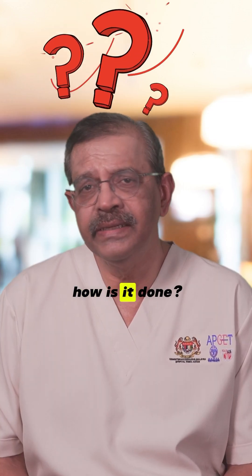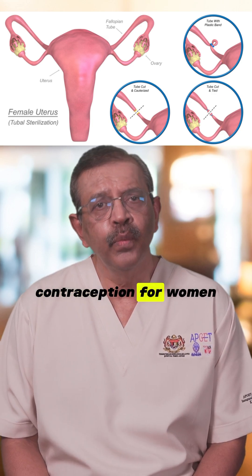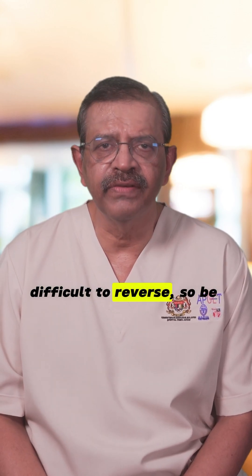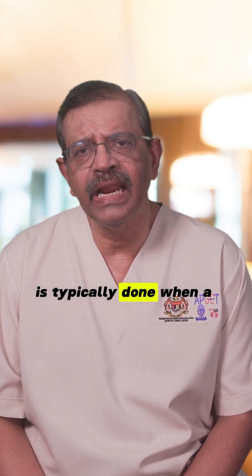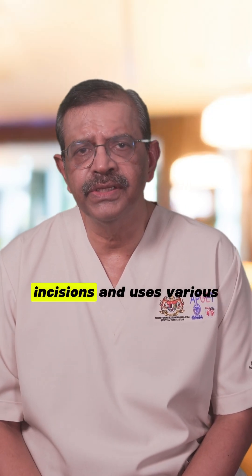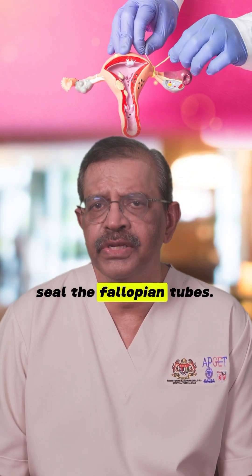Laparoscopic tubal ligation — how is it done? Tubal ligation is a permanent method of contraception for women who are certain they do not want any more children. Once performed, it's very difficult to reverse, so be careful. Laparoscopic tubal ligation is typically done when a woman is not pregnant, known as interval sterilization. It involves small abdominal incisions and uses various techniques to block or seal the fallopian tubes.